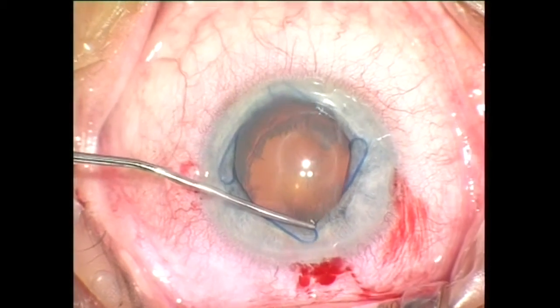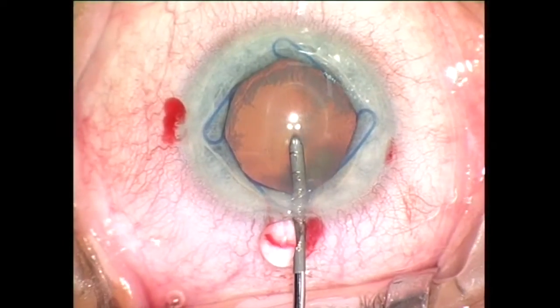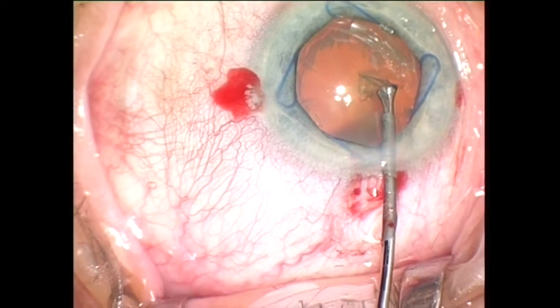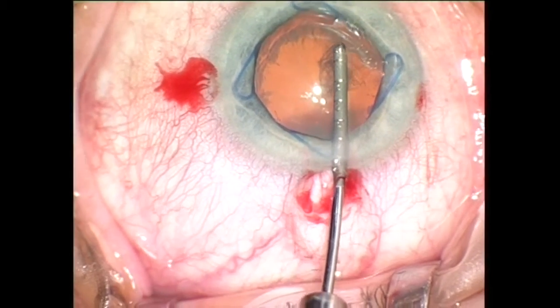The new version of the Malugin ring is very gentle to the iris, providing controlled stretching and expansion of the pupil. The very low profile of the device does not restrict the movements of the instruments in the anterior chamber.